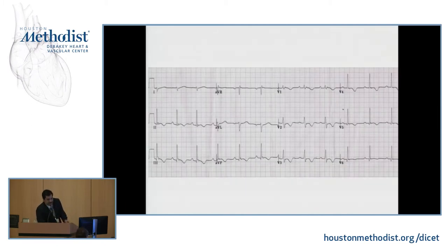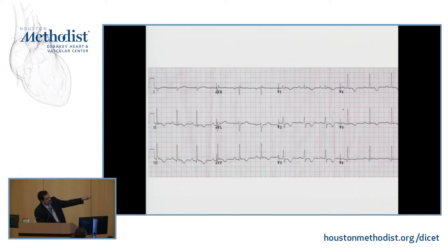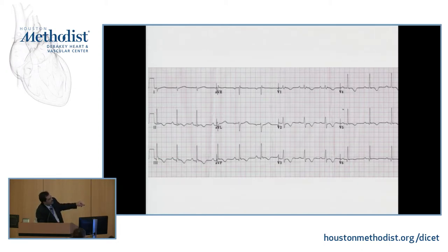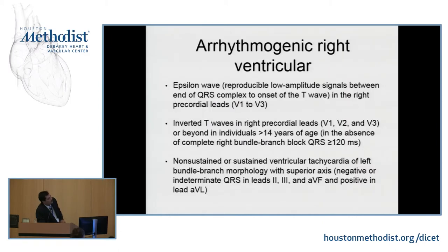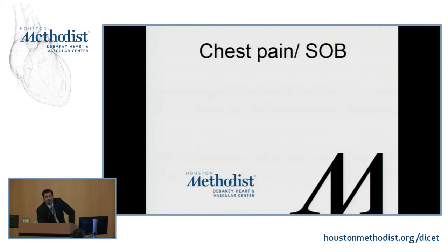Another classic in sudden cardiac arrest: this is the famous epsilon wave — this small notching you see right here. This EKG is from arrhythmogenic right ventricular dysplasia, where you can see this tiny fluctuation — the epsilon wave — along with deep T-wave inversions in V1, V2, V3, V4, which are additional criteria. If you also see non-sustained or sustained ventricular tachycardia with left bundle branch block morphology and a superior axis, that's usually suggestive of ARVD. We typically diagnose this with cardiac MRI.